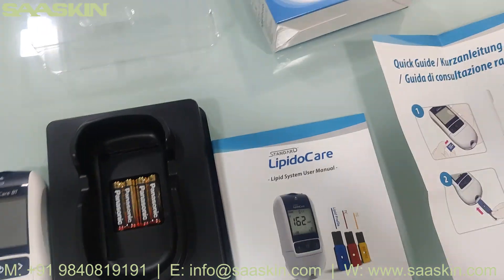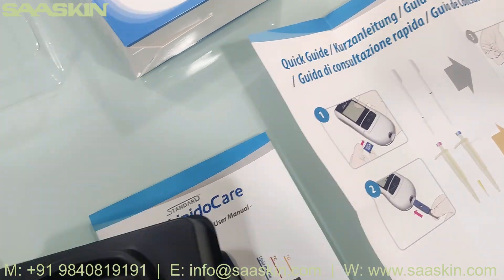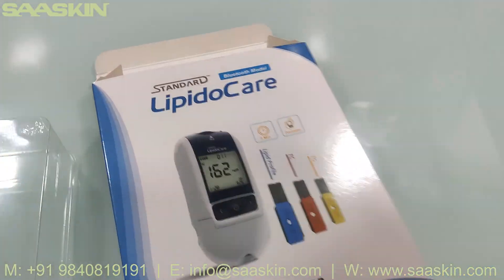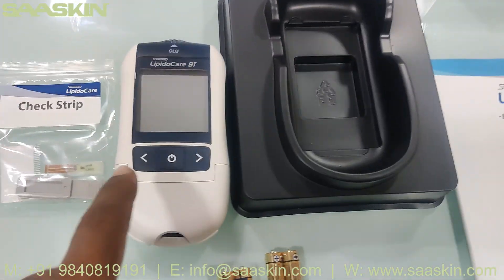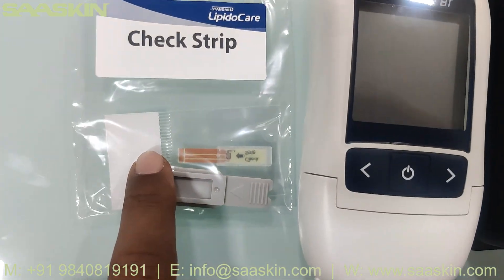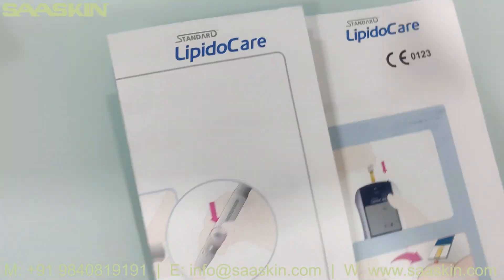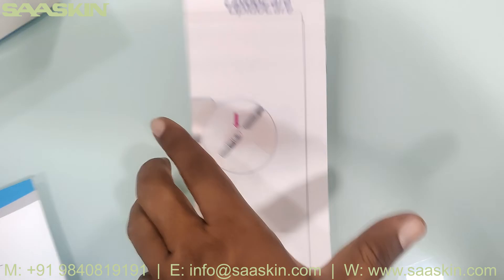You can see the batteries are also included here. In this Standard LipidoCare pack, you get one LipidoCare analyzer machine, the check strips, the batteries, one lipid system user manual, and one quick guide.